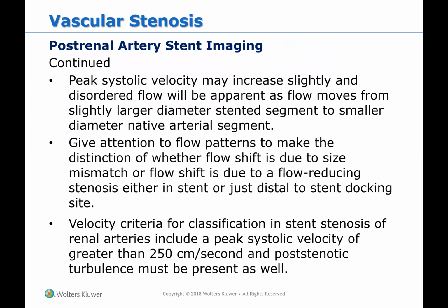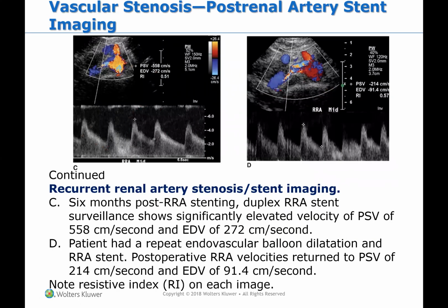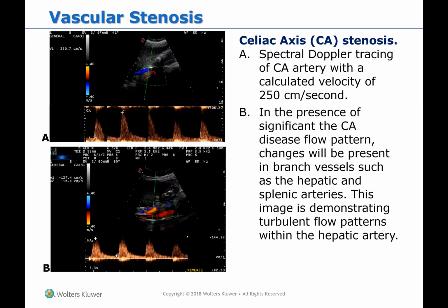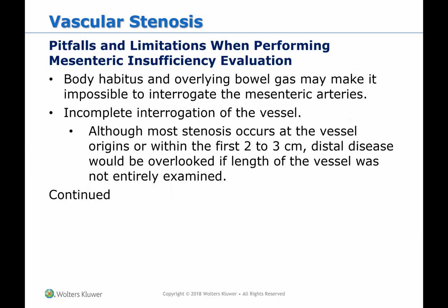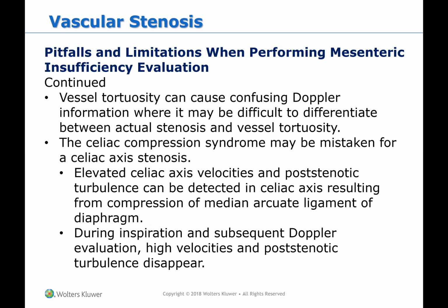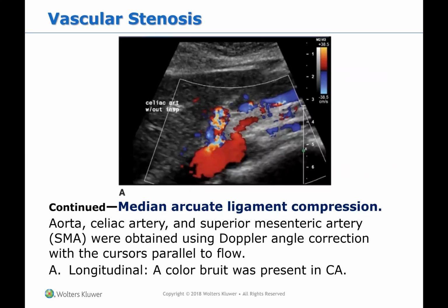I'll let you look at stent imaging because I know this has taken forever. I would go over and be pretty familiar with mesenteric artery stenosis too, and what happens with that. There are a lot of pitfalls.